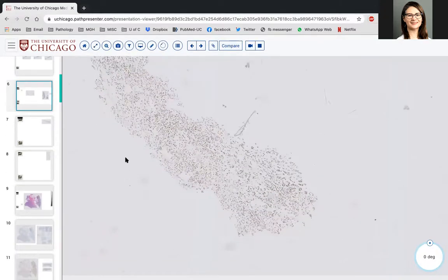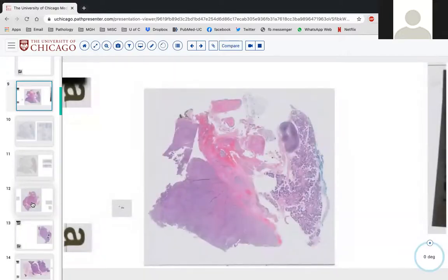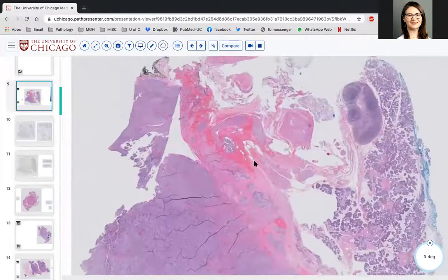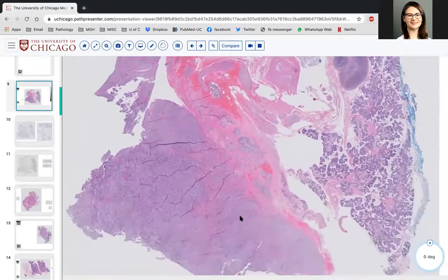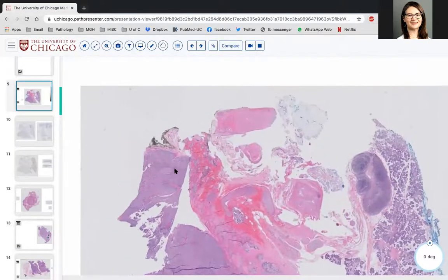So what's our final diagnosis going to be on this case? On our top line? Low-grade salivary neoplasm. Mhm. Yeah, I think, and then you just be descriptive. But then they would excise it, and it looks like they did. Yeah, so excision, low-grade biphasic salivary gland neoplasm, I think is completely reasonable, but putting that differential diagnosis in the comments, I think is very helpful for surgeons to sort of know what to expect when it comes out, right?